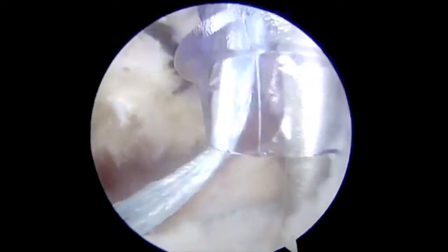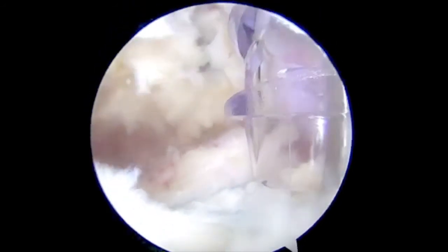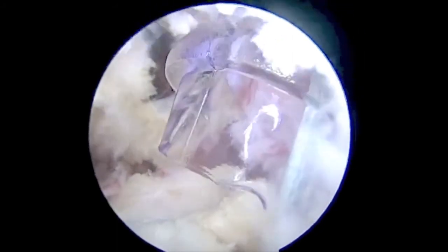A punch for the second lateral row anchor is made. One tape strand from each medial row anchor is passed through the eyelet of the swivel lock and the anchor is placed on the superolateral aspect of the subscapularis footprint. The fiber tapes are cut flush to the anchor with a suture cutter.